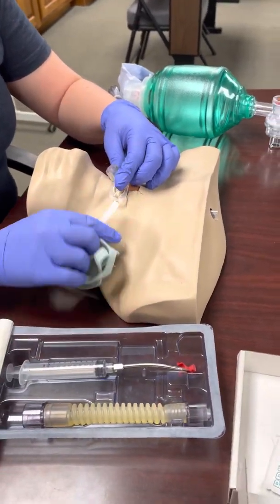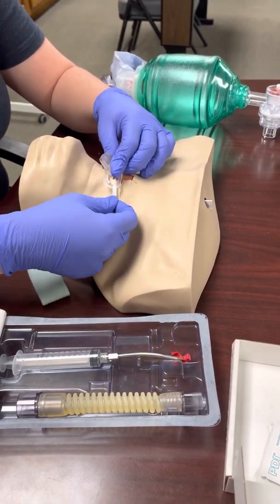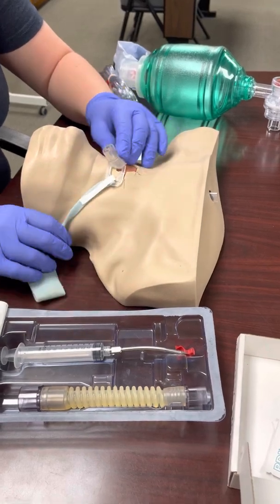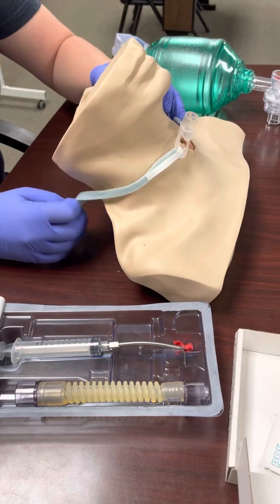You need to secure it right away. This strap just goes through here. It is naturally going to want to come out, so make sure you are securing it to your patient as soon as you've confirmed you're in the trachea.